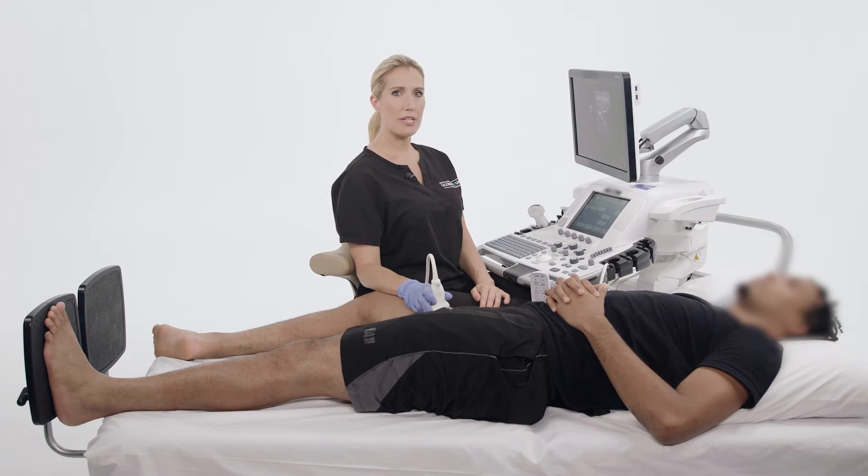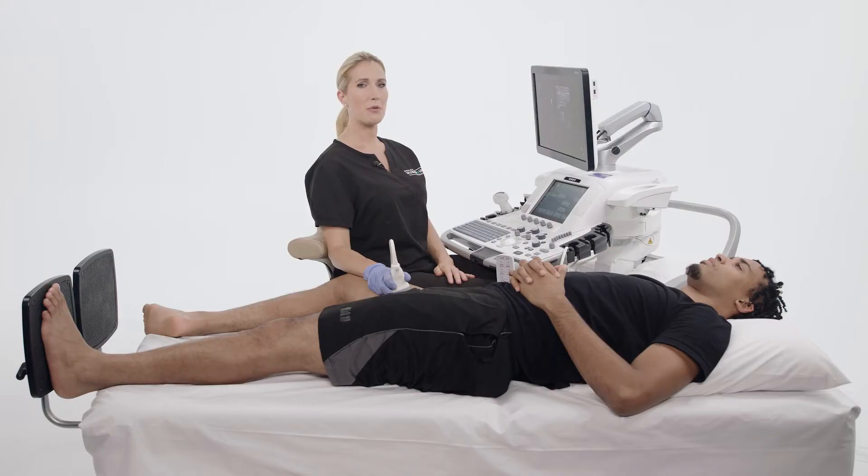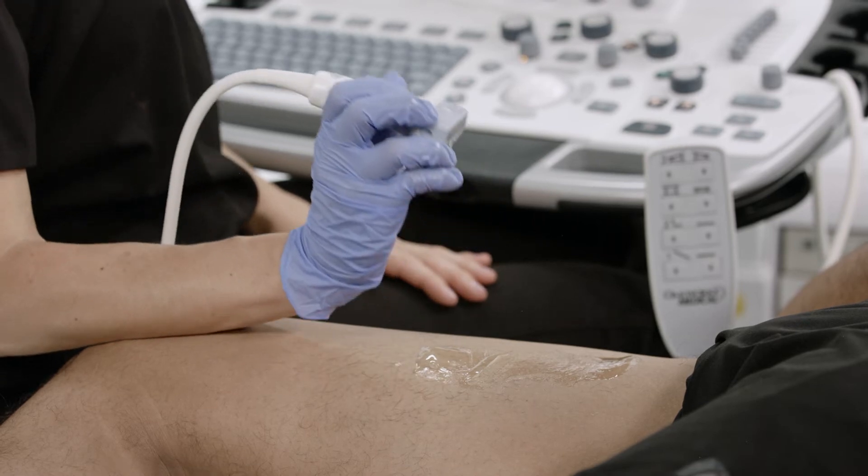Moving distally, we must also consider the wrist. Just like the arm, it should be aligned in a natural position. Ensure that your wrist is neither too flexed nor too extended. The most frequent mistake seen in the vascular imaging field is overextension of the wrist.